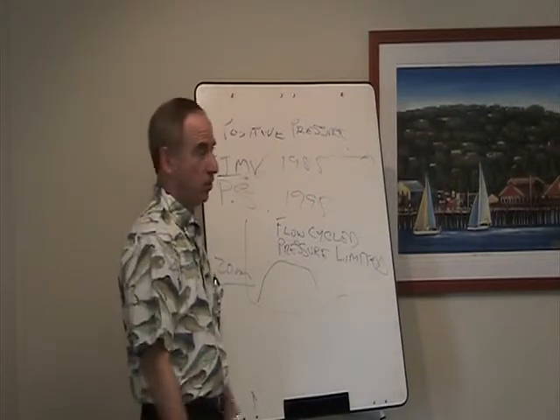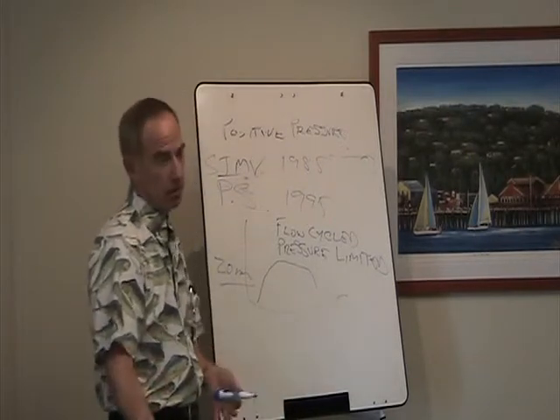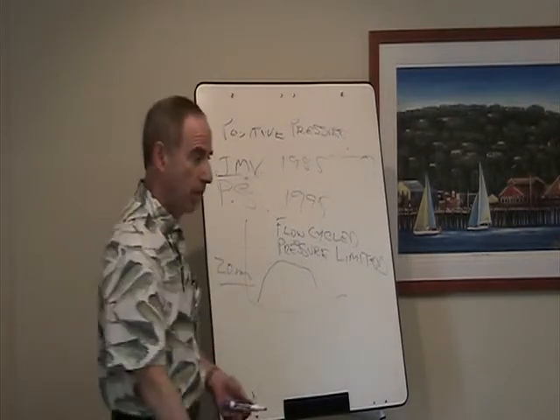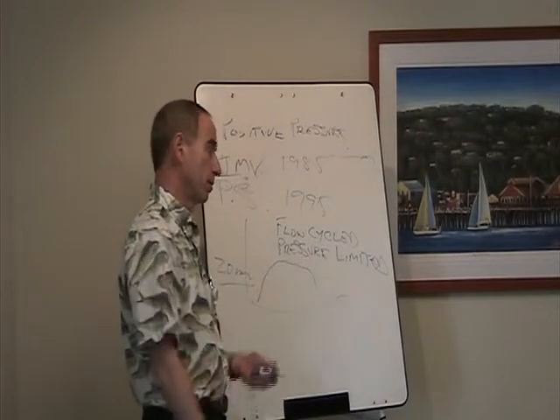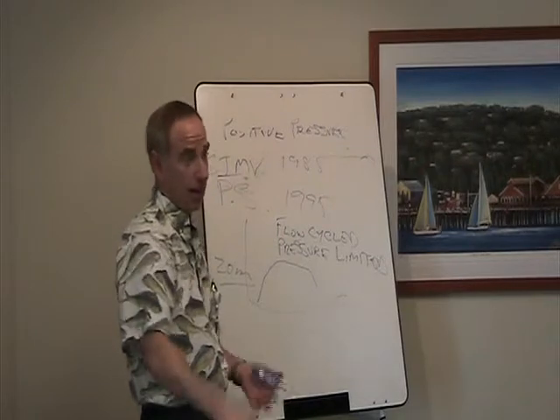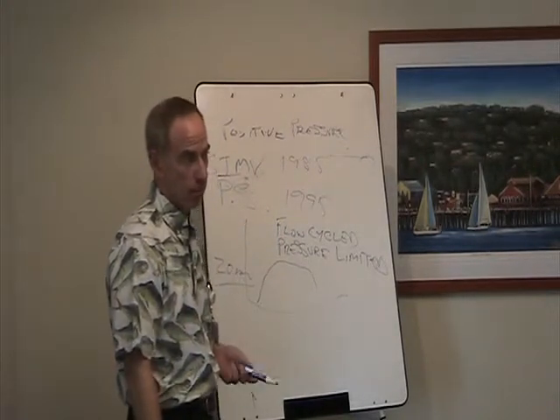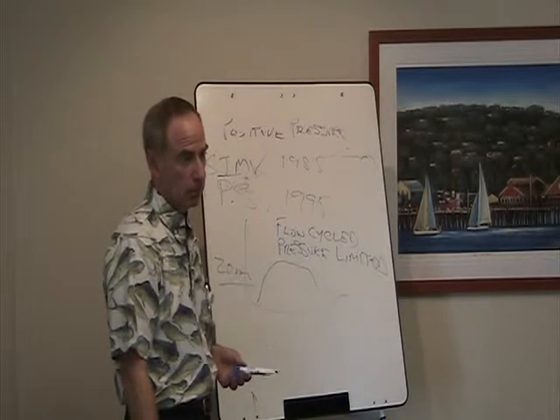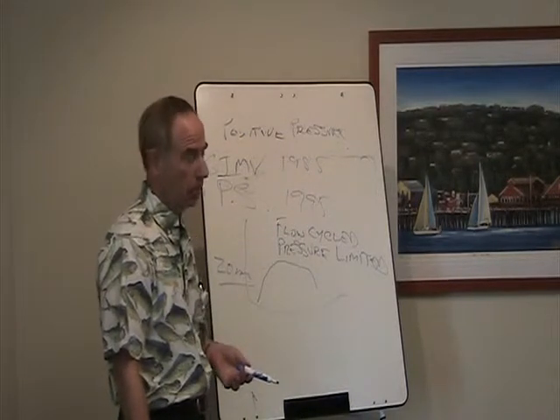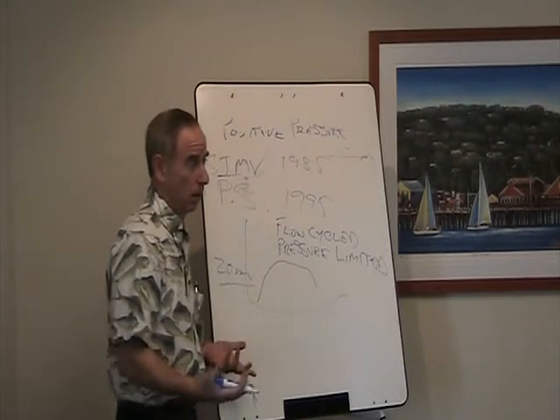Maybe the patient takes a really big breath sometimes. Another time they take a very weak breath. Well, I'm going to give them the same amount of support with each of those breaths. So sometimes it's going to help them a lot. Sometimes it's not going to do anything for them. Makes sense? Okay.